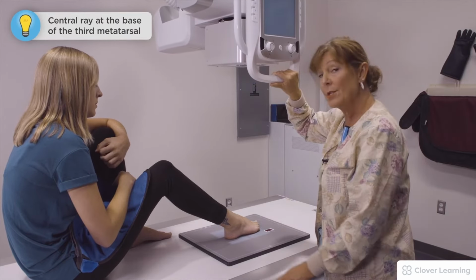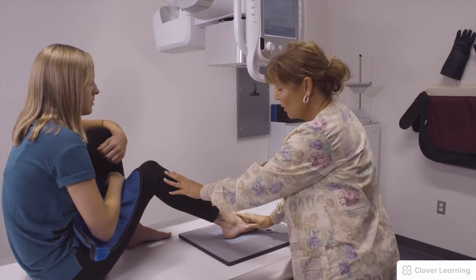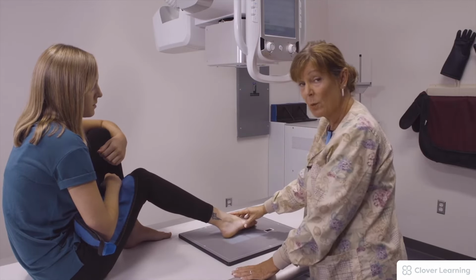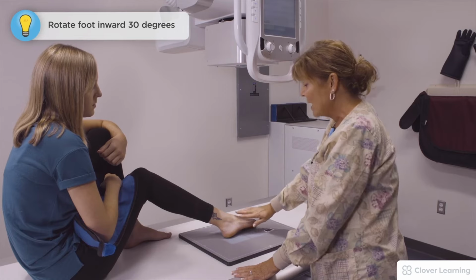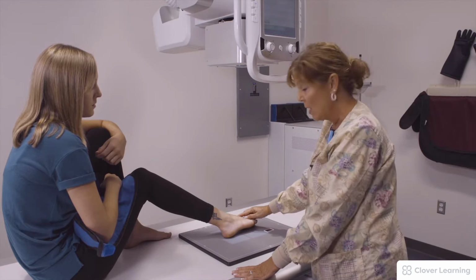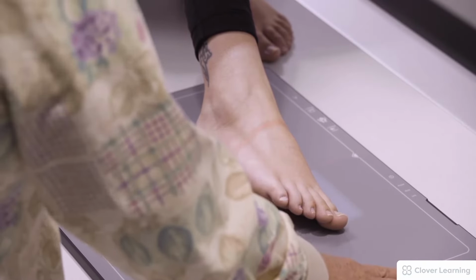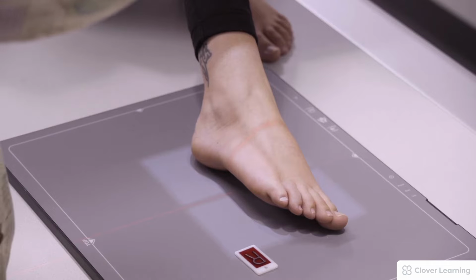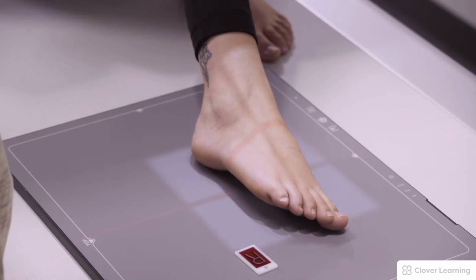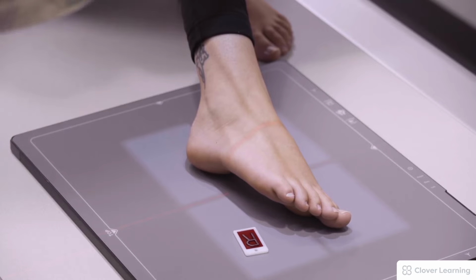We're still going to center to the third metatarsal, and we're going to rotate the body or the foot inward, medial rotation of 30 degrees. A steep rotation would superimpose the metatarsals. So we're only doing about 30. This will show us the cuboid. We're still centered right there on the third, centering to the IR. And that is the medial oblique of the foot, and we hold very still.